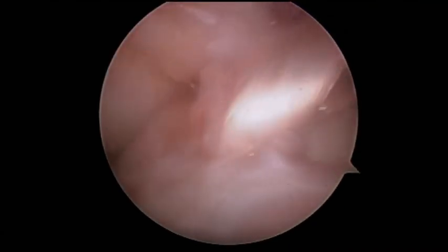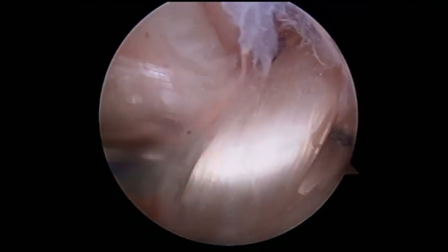The fixation of our graft is then verified arthroscopically.